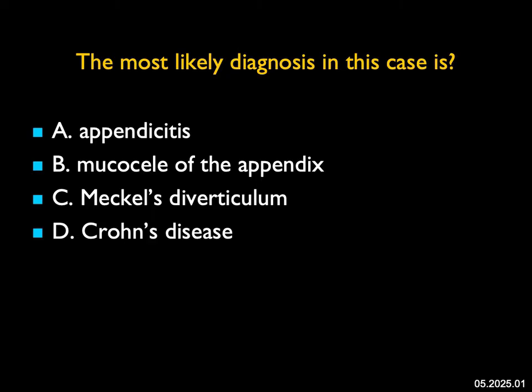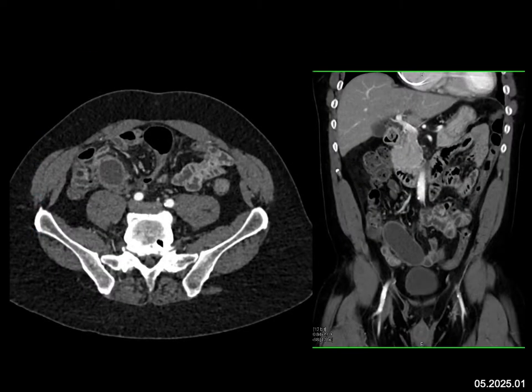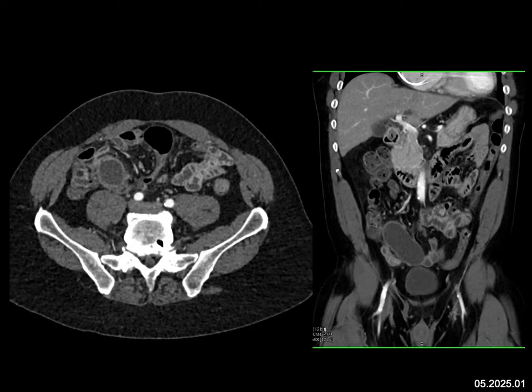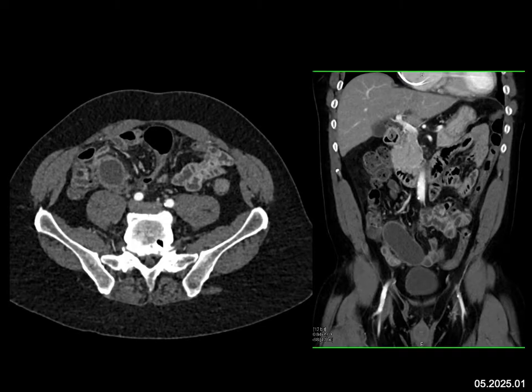The most likely diagnosis in this case: we look at the abdomen and we see a cystic lesion in the right lower quadrant. When you look at the coronal, it's really oval and tubular. It's not the terminal ileum. There's no dilated bowel. I don't see any local inflammation, but it's a tubular structure. So you've got to be thinking this must be the appendix. But when it's dilated to two centimeters, water density, thin wall, and no local inflammation, that's not going to be a simple appendicitis.